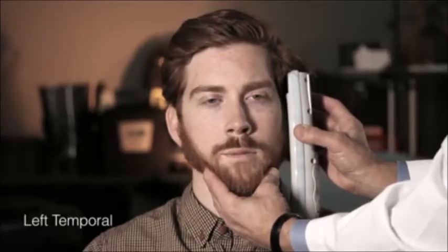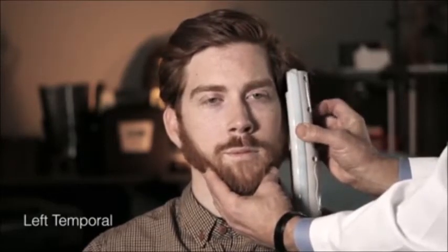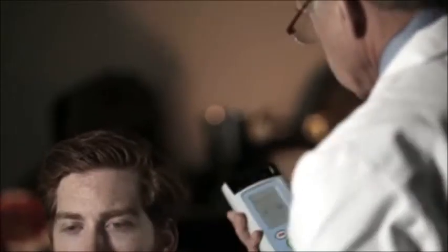Next, we select a point in front of the upper portion of the ear, about at this level. We move the probe so as to separate the hair, wait for the signal, and confirming the correct location and the correct reading. Again, anterior to the ear, in the temporal fossa, working through the hair to get down to the skin, depress, and again we see the symmetrical reading.